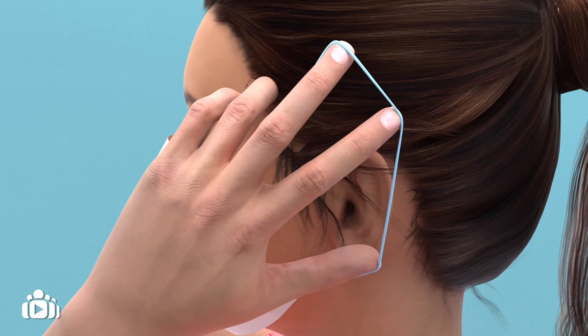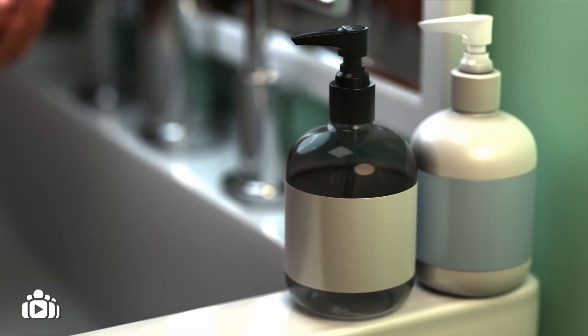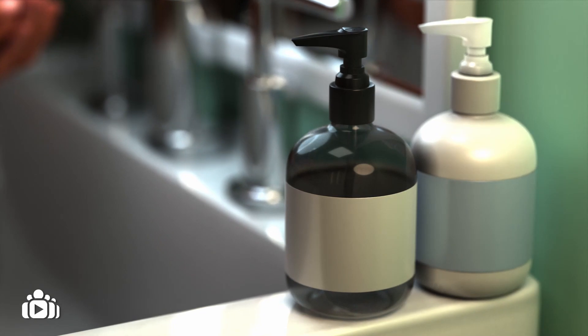Everybody in the room should put on a surgical mask. Wash your hands thoroughly, firstly with normal soap and then again with hydro-alcoholic solution for at least 30 seconds.